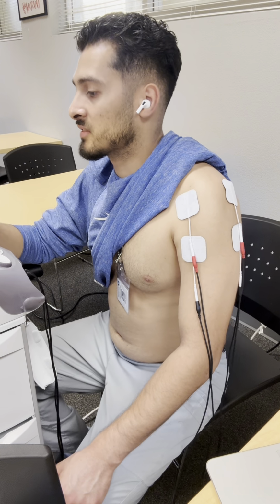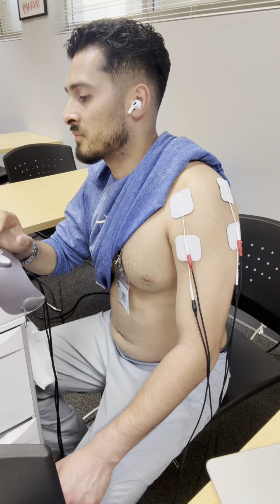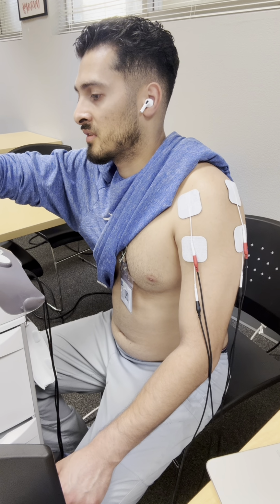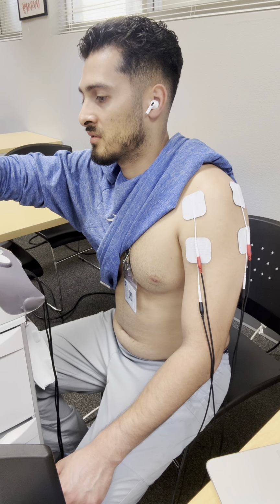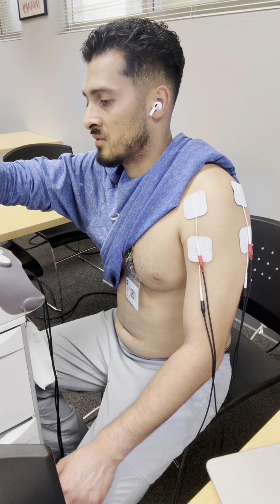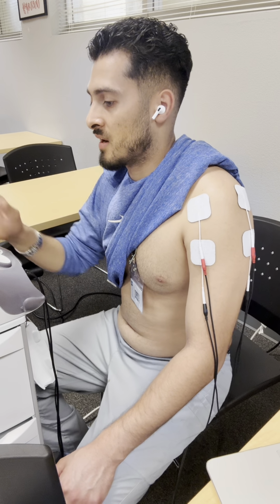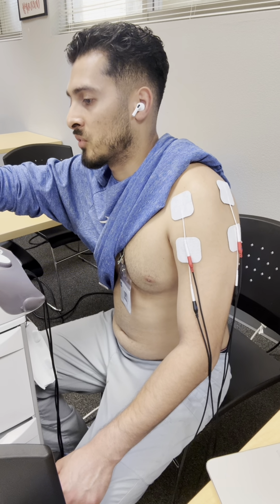I'm gonna start messing with the vector positioning there, see how it changes. So I can definitely feel how that changed it down from one channel.